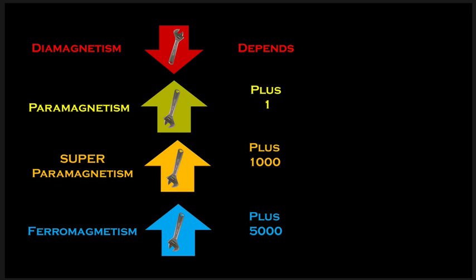Now, most things in the body, biological tissues, are actually weakly diamagnetic, and it's on a spectrum. Water, fat. Calcium is actually the strongest diamagnetic substance in the body. It's sort of why you see signal drop out along the cortex of the bone, etc. That's most of the stuff in the body.